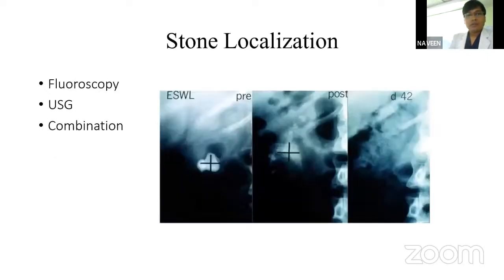So various jellies are available for coupling. Silicone jelly, petroleum jelly, and USG jelly are used for coupling. Now come to the third component, stone localization.